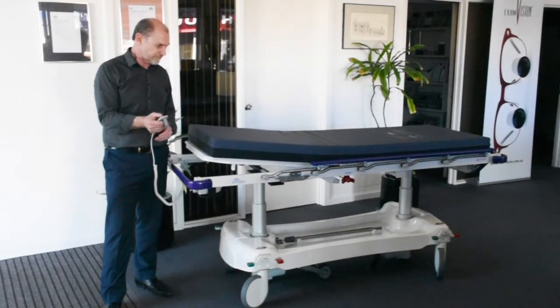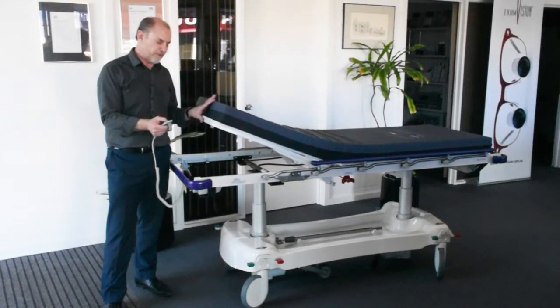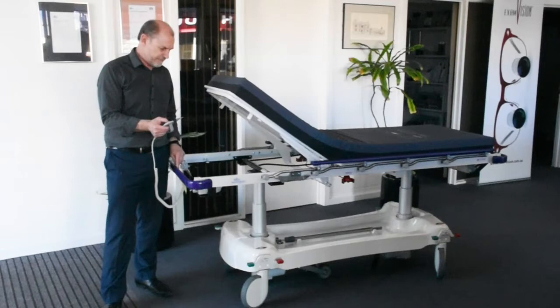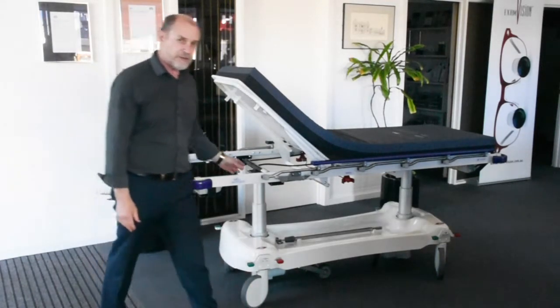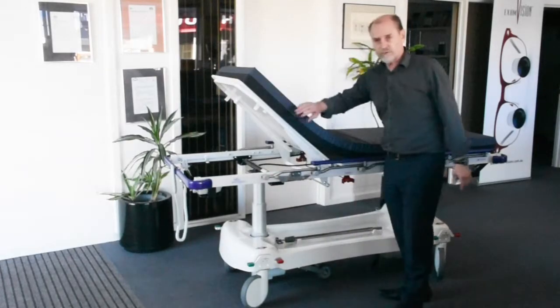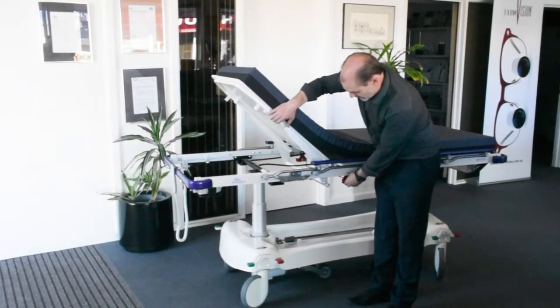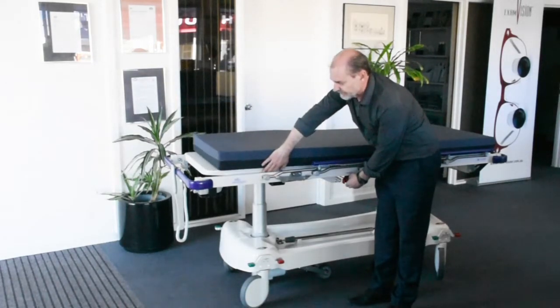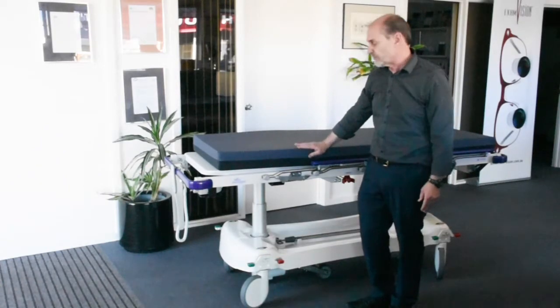The backrest comes up very smoothly. The noise you're hearing is not the mechanical part — it's the mattress bending. There's an emergency release: if you need to drop the patient quickly to do CPR, just press and pull this button and it releases the backrest down. Use that only for emergency situations, not routinely to drop it down.